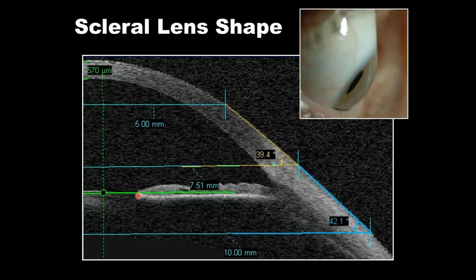So related to the scleral story and our Medmont topographer, how do we use this instrument for scleral lens fittings? One of the valuable findings that came from Pacific University was to understand the angle that begins to form in the peripheral cornea that generally runs through the limbus and onto the sclera till about 20 millimeters diameter across the eye.